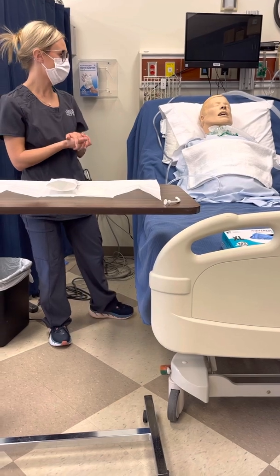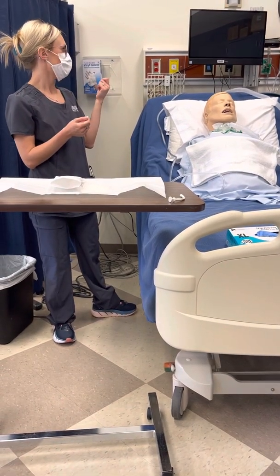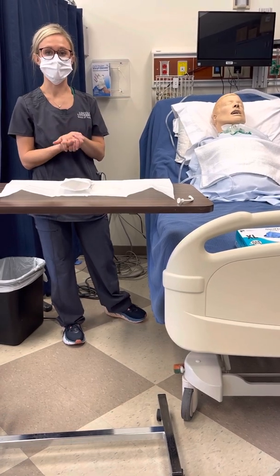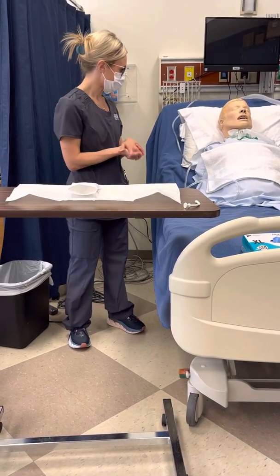Again, his breathing sounds. I'm going to turn the suction back to normal settings, and I'm going to turn his oxygen also down to normal settings. Mr. Jones, you did a great job.